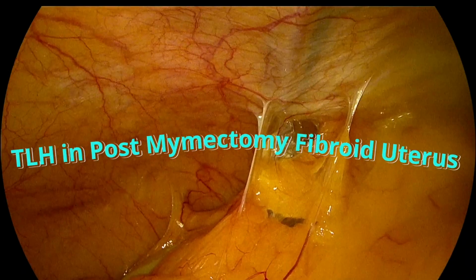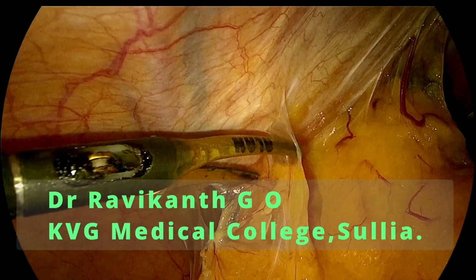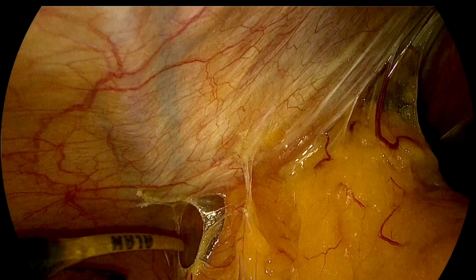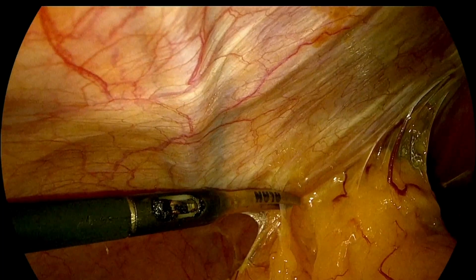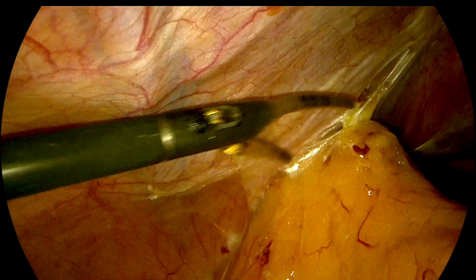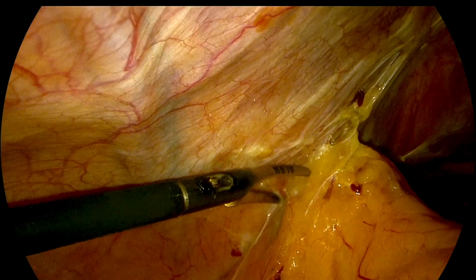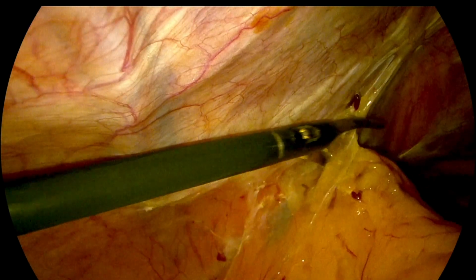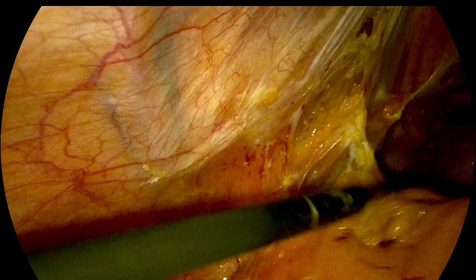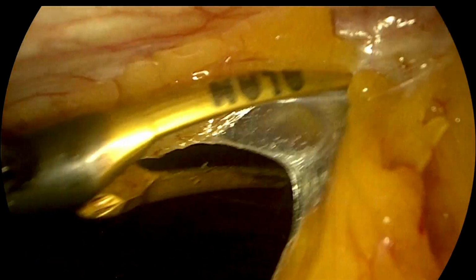Hi, I am presenting a case of total laparoscopic hysterectomy in a patient previously operated for a myomectomy, and who has also undergone a left salpingo-oophorectomy. As anticipated in any patient with previous surgeries, some amount of omental adhesions to the abdominal wall is released. On the left side, it was adhered to the left lateral wall of the abdomen. And once we released it, we got the exposure to the pelvis.